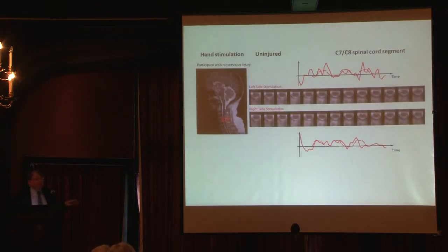So I'm not going to talk any more about methods. I want to jump right into results. These are what our results look like. This is from a healthy, uninjured volunteer. And these images are showing left-hand stimulation and right-hand stimulation.